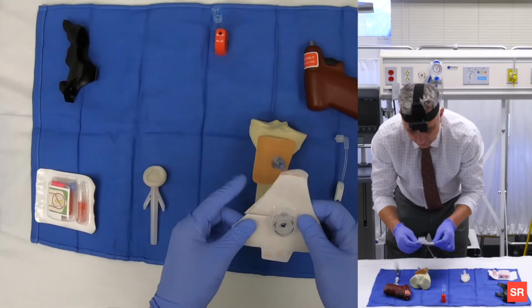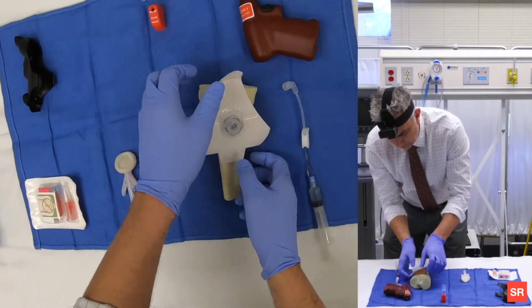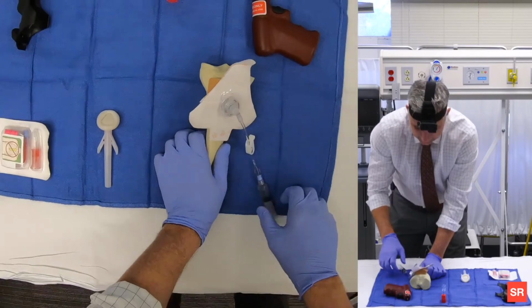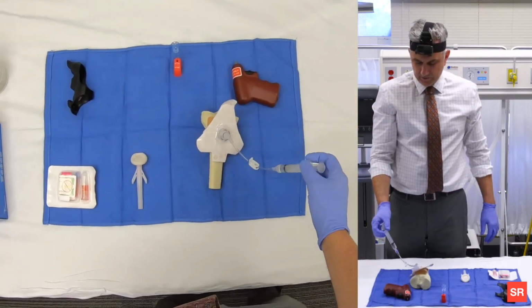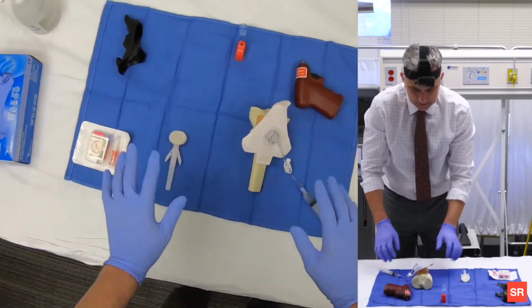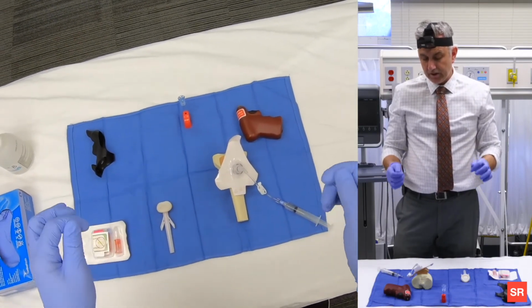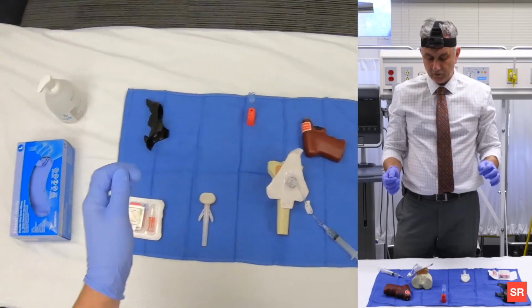I'm now going to place on the dressing. This goes over here, and I pull these 2 tabs to secure the dressing, and I'm going to reattach my IV. This can now be hooked up to an IV line with a pressure bag or a pump. At this point, I've placed the intraosseous needle. I'm going to then record the procedure in either the medication administration record or our medical record.